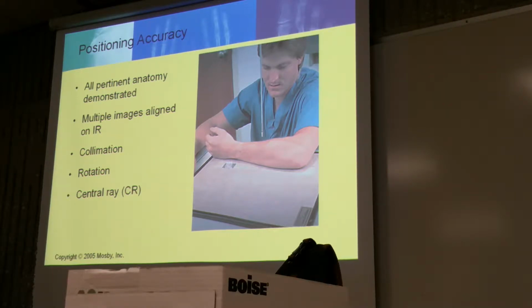All right, positioning, accuracy, all pertinent anatomy must be demonstrated. We generally do, how many views of anatomy do we take? At least 2. We usually take them at 90 degrees from each other. That is the practice. That's what you have to do. Okay?